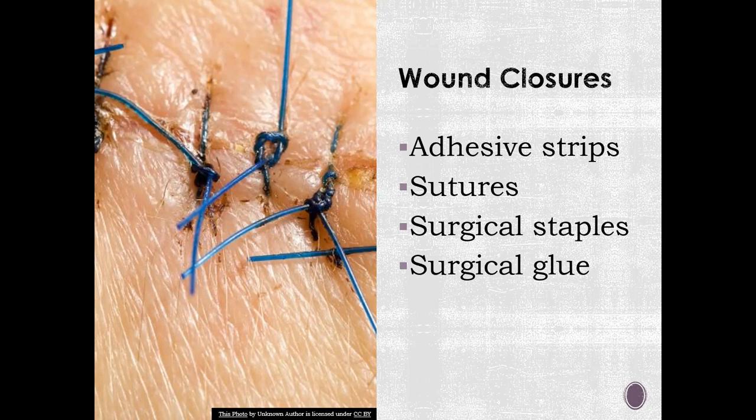And then we have non-absorbable sutures. So these are placed in superficial tissue. They're going to require removal, and nurses are able to remove them.